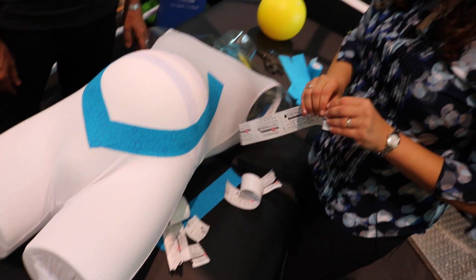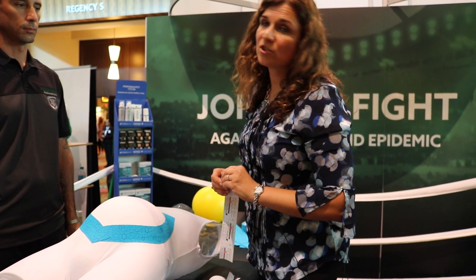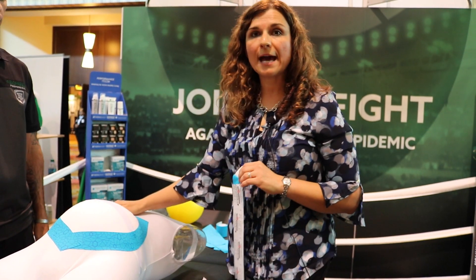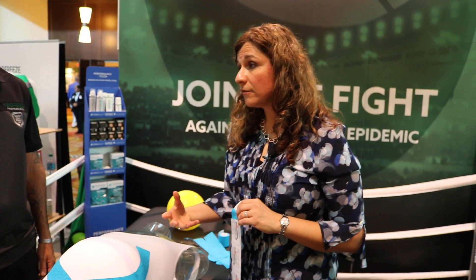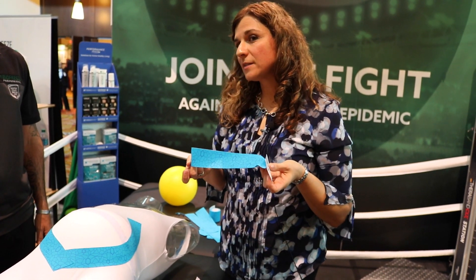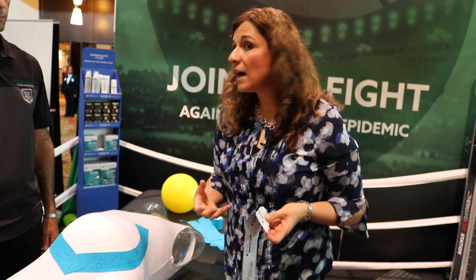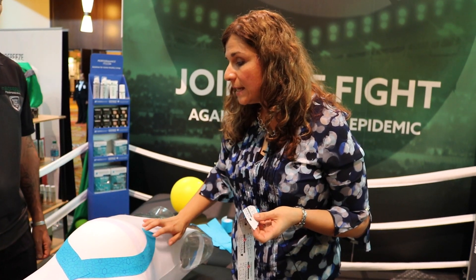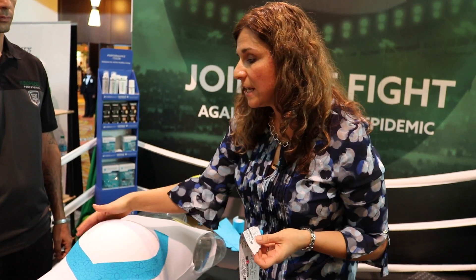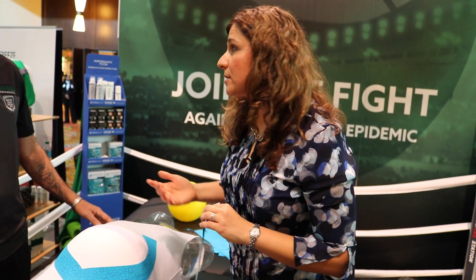I will tell mom she can easily do this at home, having somebody help her so she doesn't have to come in every time. Some patients will say that just placing the horseshoe — as I like to call it — around the abdomen is more than enough to support their abdomen and they feel comfortable. I like to add that extra support piece across the midline. Especially here in Florida this works great, because a lot of times we give pregnant patients a trochanteric or pregnancy support belt, but they're hot and sweaty, so patients don't like them. Giving them the extra support with tape actually really helps.